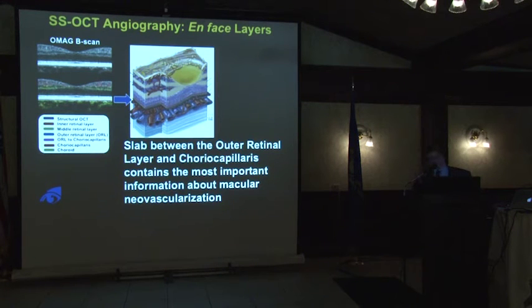But if we really appreciated that we could have found those lesions, perhaps we should have been doing it and looking for them. But now we don't have to do it because we have OCT angiography. And I just want to emphasize this ORC slab. Remember, we're getting rid of most of the retina and most of the choroidal circulation. We're just looking at this thin layer, all right?